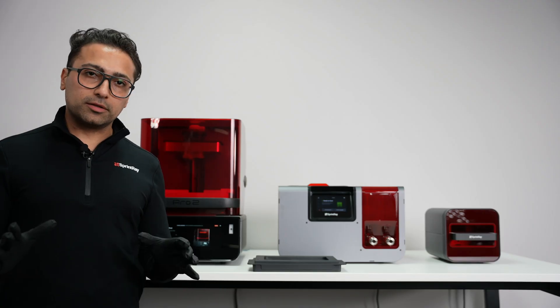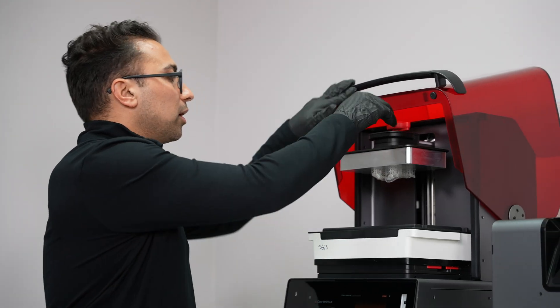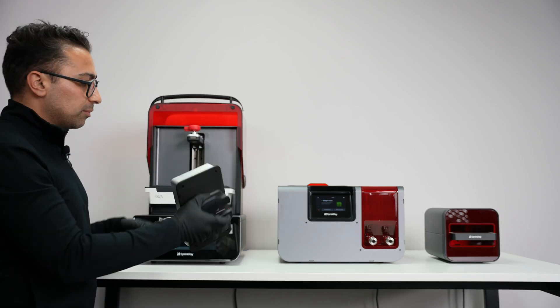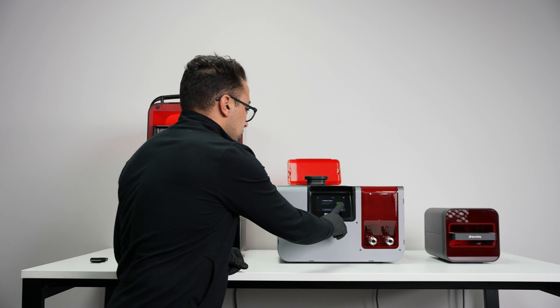Once the print is completed, cover the resin tank if you're not using it anymore and start by unlocking the build platform. Remove it from the printer, move it to the wash, and tap on start cleaning.